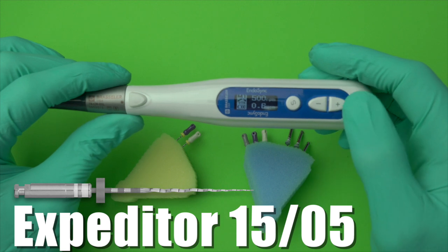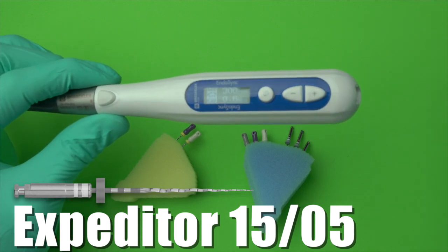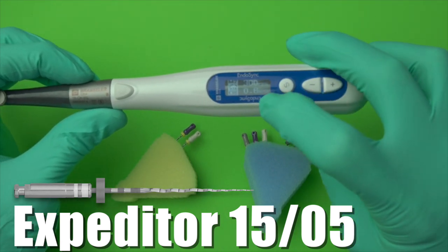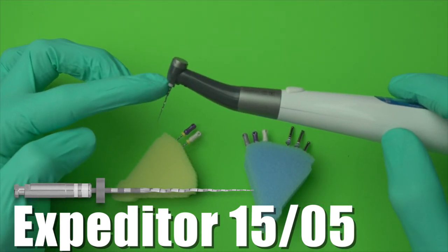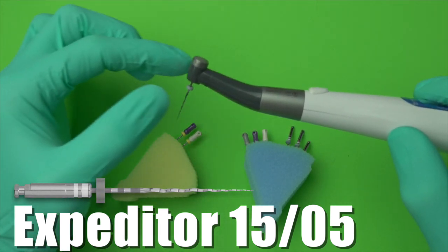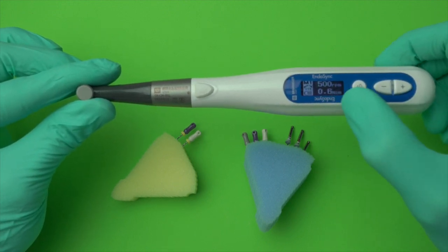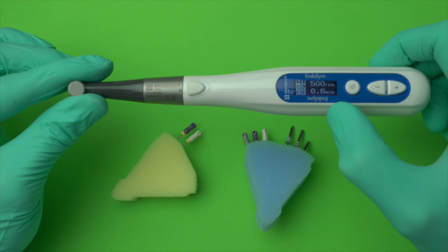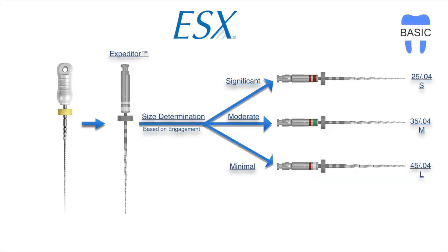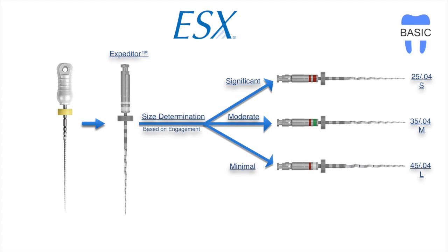At that point I connect to the EndoSync AI apex locator for a live reading. Because I have apical stop on, as soon as I reach full working length the file comes to a full stop. I adjust the stopper to the working length at the reference point, then disconnect the handpiece from the apex locator and move back up to memory 1 — 500 RPM, 0.6 newton centimeters of torque with OTR. Based on the ESX algorithm and the engagement felt, I choose the appropriate ESX finishing file to complete the case.